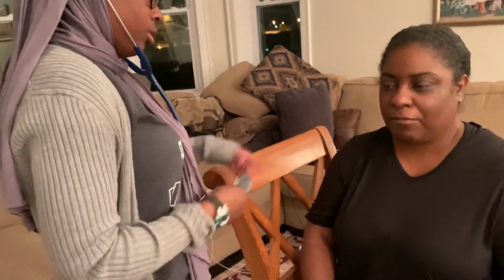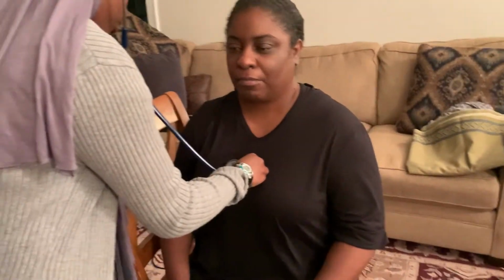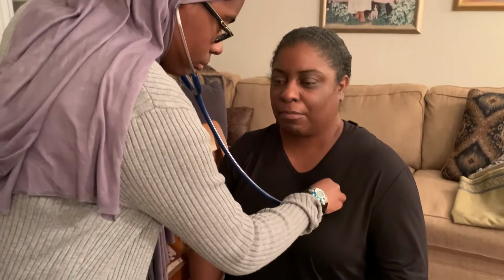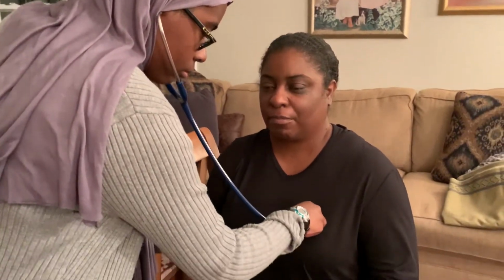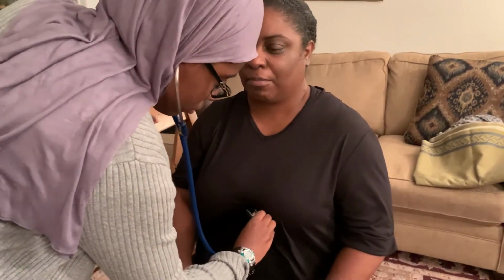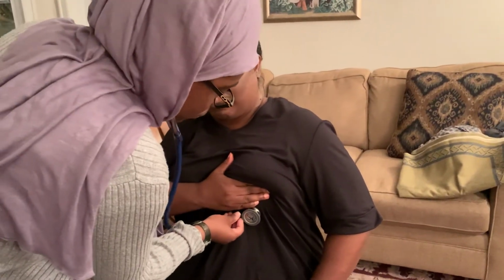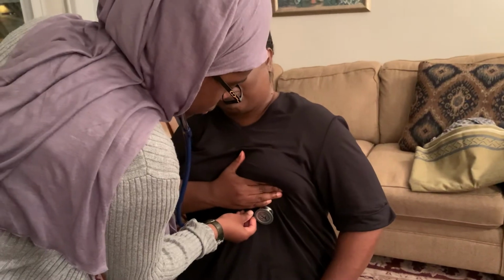Okay. I'm going to listen with my bell. Aortic. Pulmonic. Erb's point. Tricuspid. Can you lift your breast one more time for me? Thank you. Mitral valve. Okay, thank you very much.